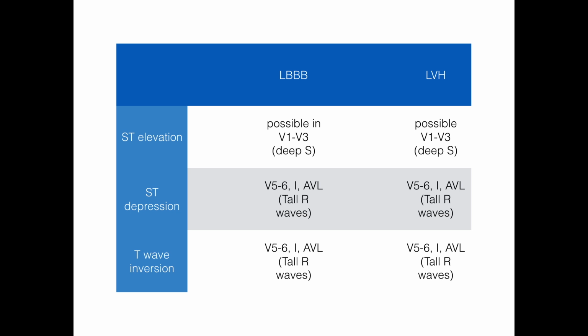Here's a chart that compares left bundle branch block with left ventricular hypertrophy, and you can pause if you want to take a look at that.